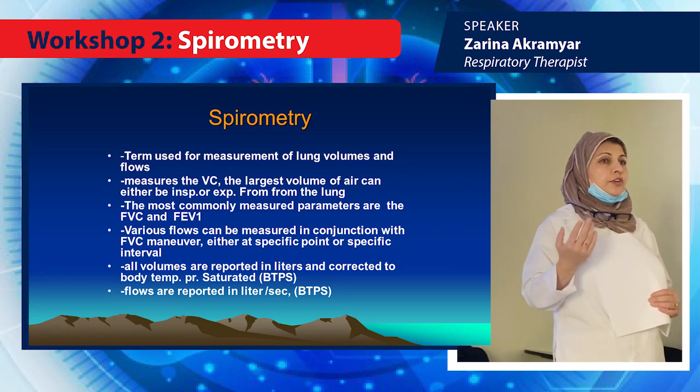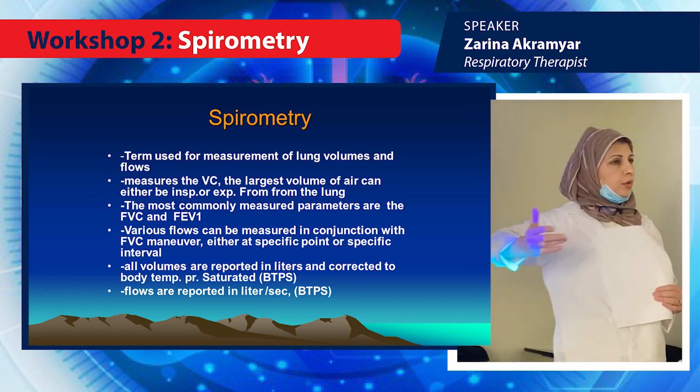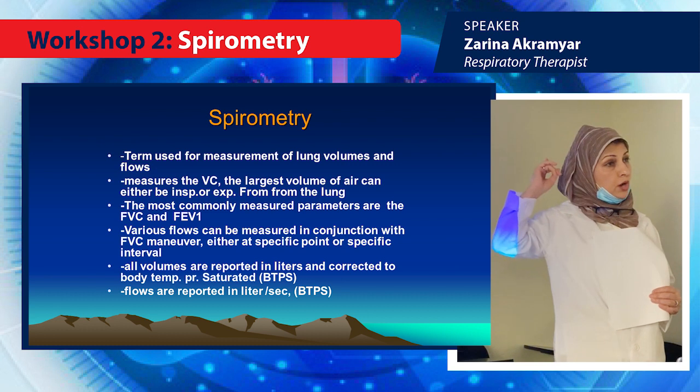It's important because, for example, if the VC is 5 liters, right? If I ask the patient to take a deep breath and blow, blow, even slowly, he will give me 5 liters. Okay? But I will not do that. I will ask him to blow hard and fast.